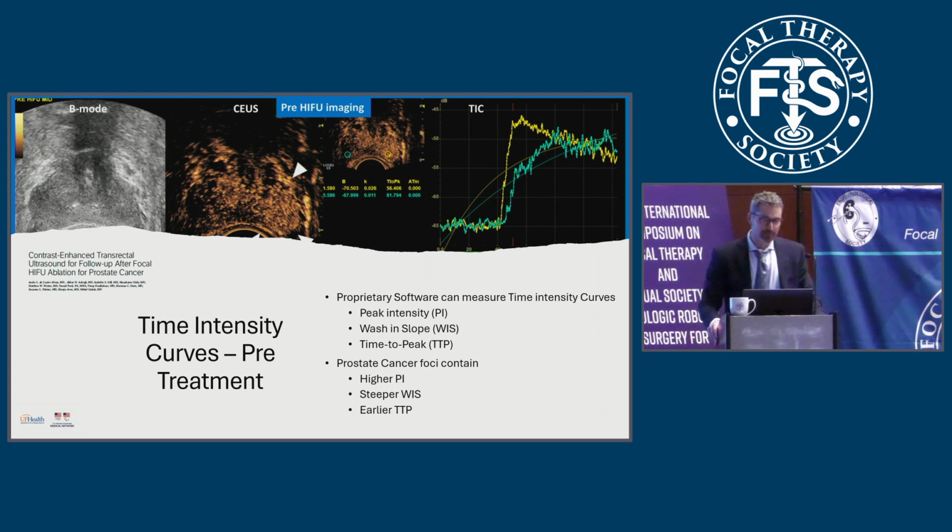Now, there was a study from USC, and I really commend them on this aspect of the study, where they utilized the time intensity curves. And I had never heard of this until I read their paper. And what it is that with contrast enhanced ultrasound, there's a proprietary software that can measure these intensity curves.